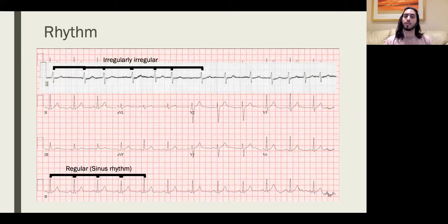Many of you may be able to recognize this is atrial fibrillation. Firstly, you don't really see any obvious P waves because your atria are producing electrical currents all over, not using the sinoatrial node. And now we know that the sinoatrial node's the thing that causes the P waves to come because your electrical potential is released from there, goes to the AV node, and that's how you get your depolarization. But in atrial fibrillation, your sinoatrial node's not really used, and you're getting little currents and little potentials all over the atria, and they're basically shaking like this, fibrillating.